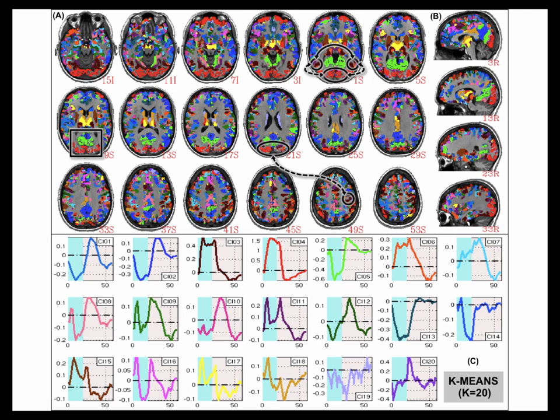Okay, and so that basically is showing that there is more signal there to be had. We'd like to not have to average for 9 hours to do it. And so our goal is either to use temporal filtering or higher field strength or other techniques to get at that goal. But we still have a long ways to go. All right, thank you.